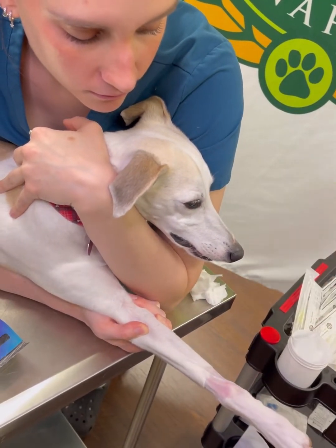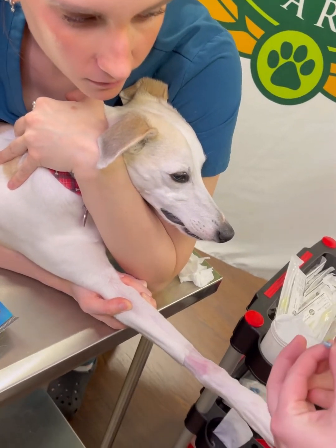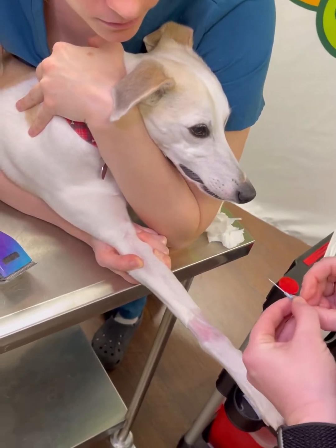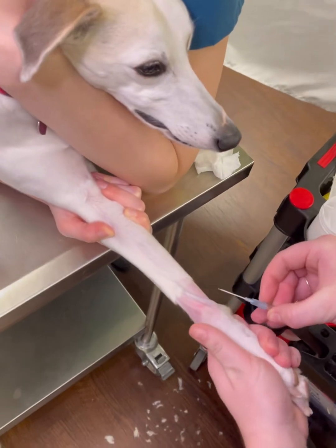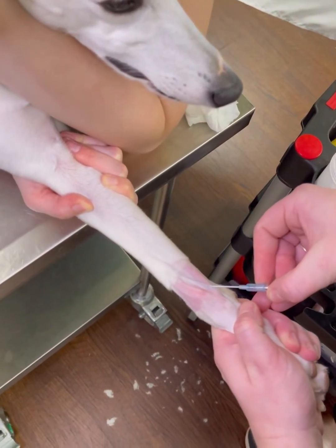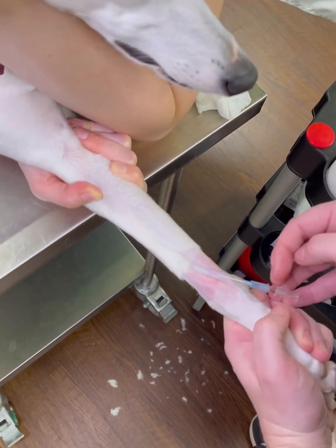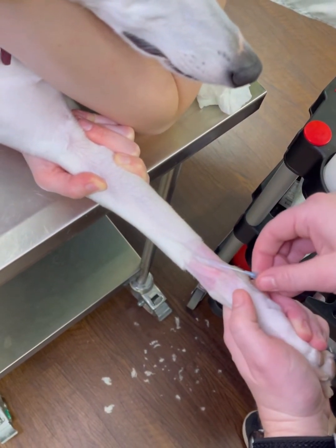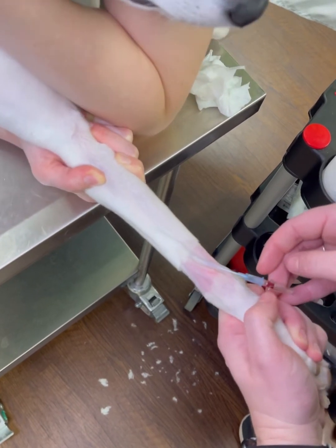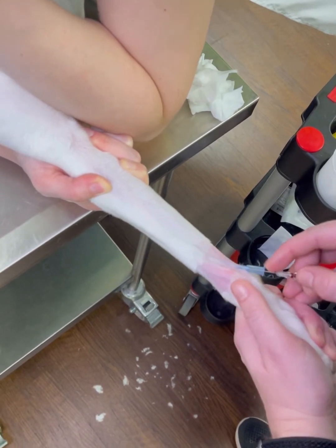Now you're ready to place. You're going to grab your catheter, take it out of the plastic — I already loosened it. We're going to start down as low on the vein as we possibly can. Start at a 45-degree angle, and you're going to insert into the skin. Once you have a flash in your hub, you're going to advance a little bit more, and then you're going to advance your catheter off of the stylet.